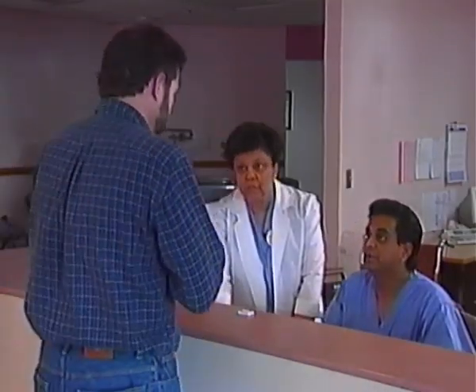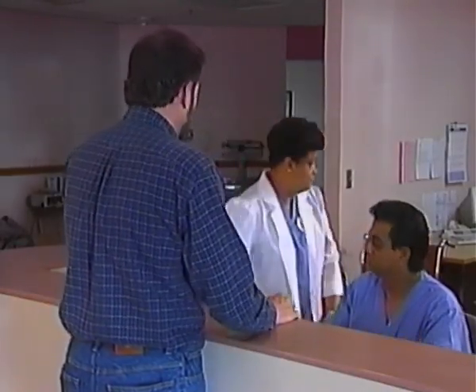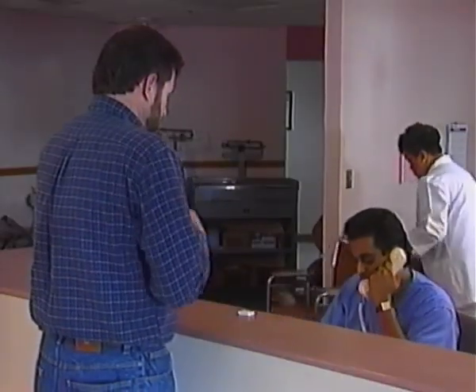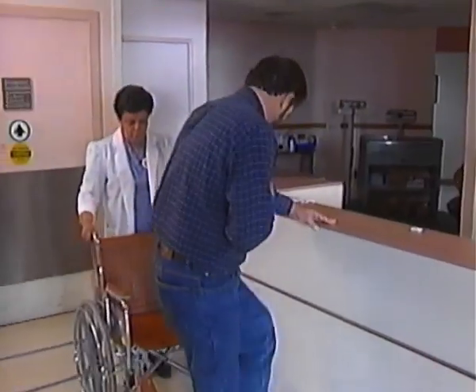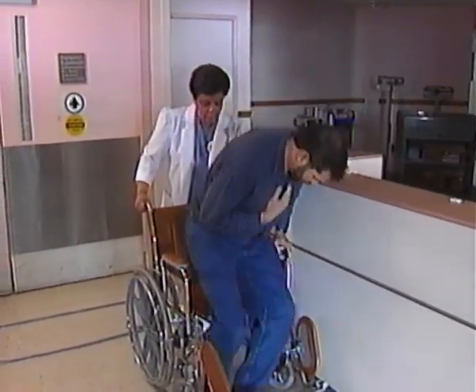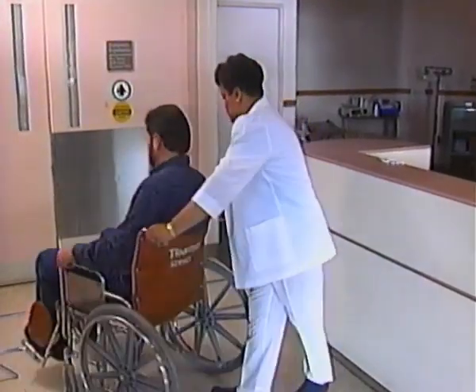Yeah, I've been having trouble breathing today and feeling pressure in my chest. And this afternoon I just have been feeling really exhausted, and I feel like my heart is just racing. Let me get you to an examination room right away. The patient's symptoms, palpitations, difficulty breathing, severe chest pressure, and weakness all indicate a hemodynamically unstable situation, which should be assessed and treated immediately.